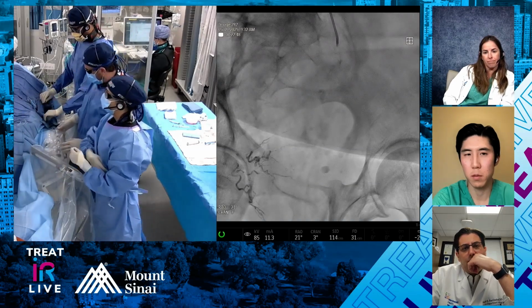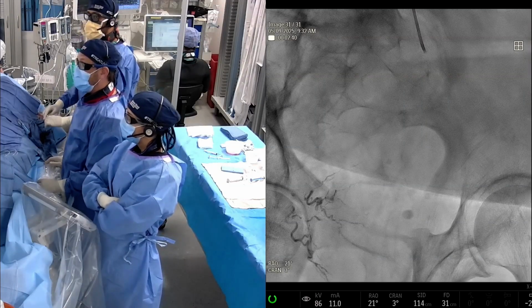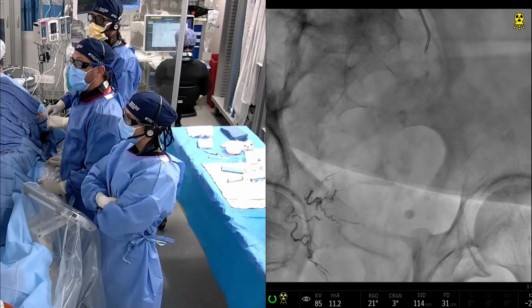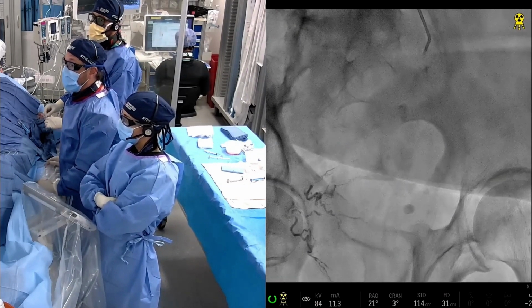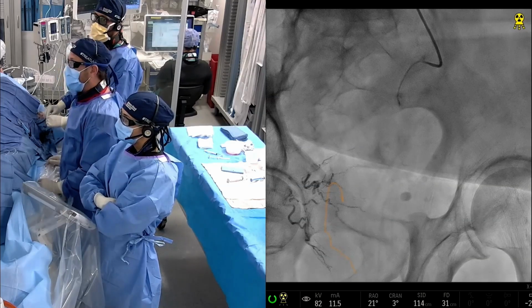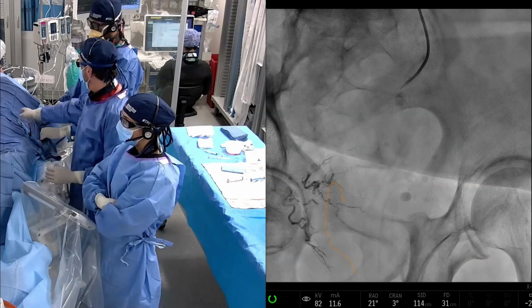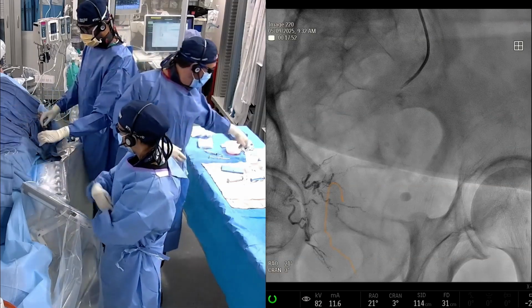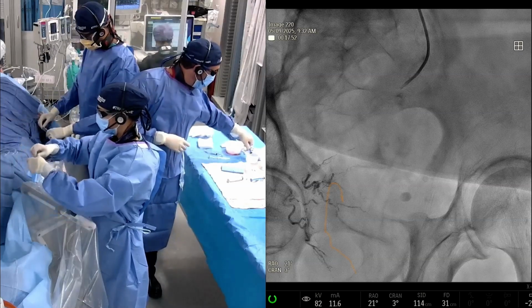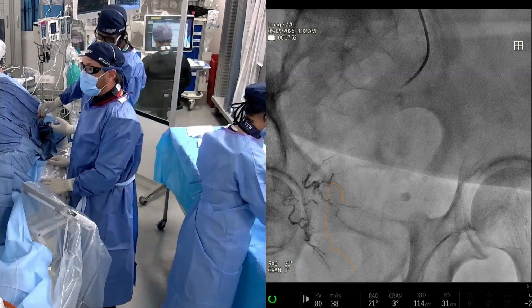Well, I'll just tell you, I use it when I need it. I know that there are some people on the panel, one in particular, that might disagree with me on that, and that's fine. We like to use cone beam CT as a problem-solving tool when we need it, but I personally like to use anatomic landmarks and anatomy patterns to try to understand what we're dealing with as best I can. So if there's a situation where I don't know what vessel I'm in, I will use cone beam CT. I also like it to look for complete coverage of the gland itself after we do an embolization. So sometimes we'll use it for that purpose, but I don't use it to find the vessels.